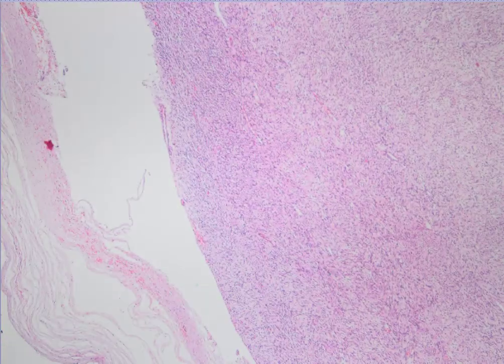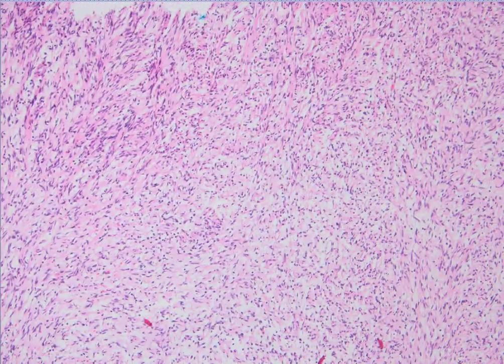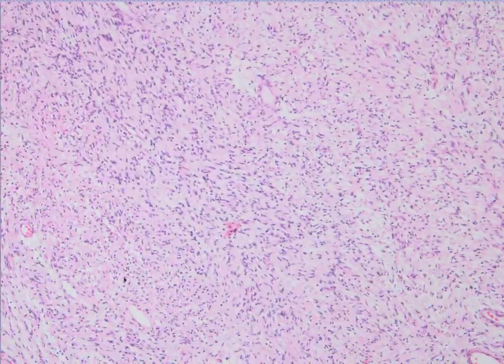And in some areas, I mean, this is normal.